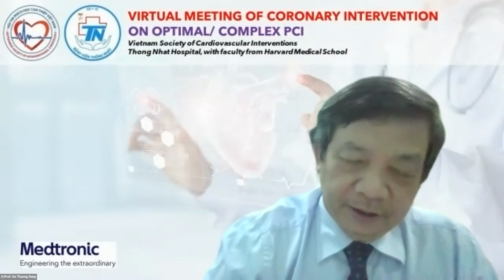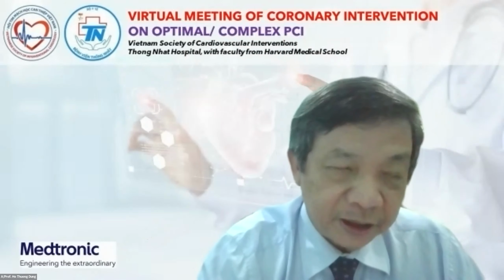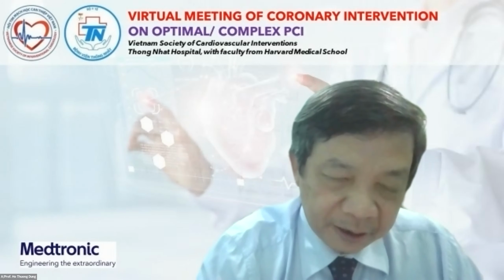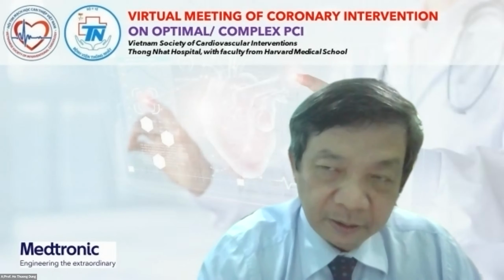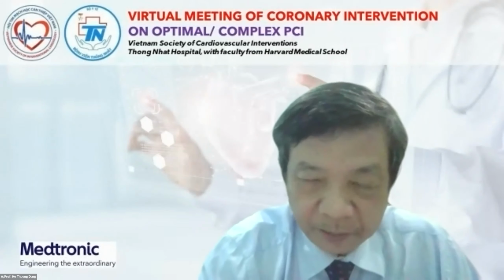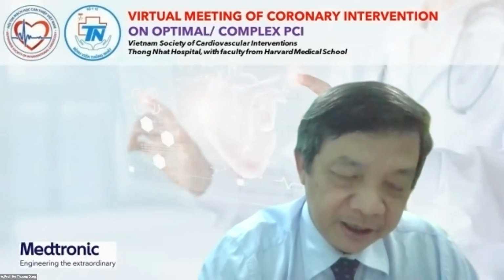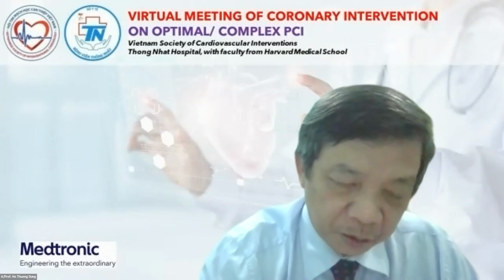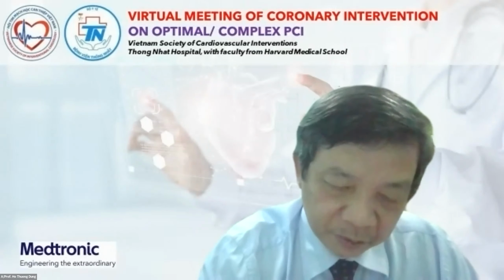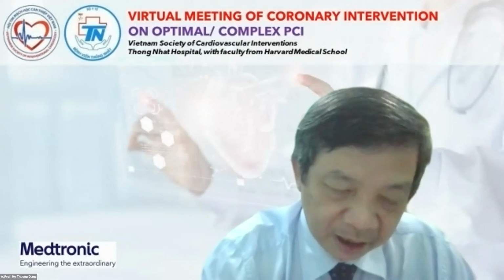Today our topic is the complex PCI. I think that nowadays complex PCI has become more prevalent because the elderly population is increasing and lots of elderly patients come to our cath lab, and to do PCI for them, we must do complex PCI. So Vietnamese interventional cardiologists should learn first to assess the complex lesion, to predict what happens when you do complex PCI, and how to solve it if a complication happens.